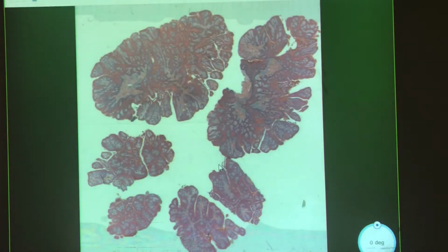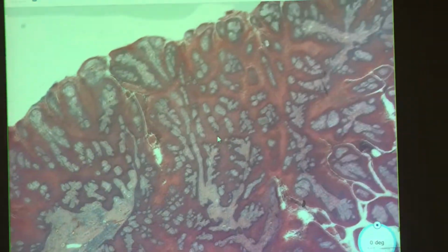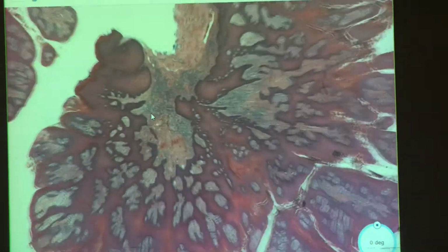Case 3. Okay. Doesn't quite look like skin anymore, but it kind of looks like a verruciform thingy. Yes. Kind of brain, actually. Alright, so what we have here, we have definitely some hyperplasia in the epithelium, epidermis.